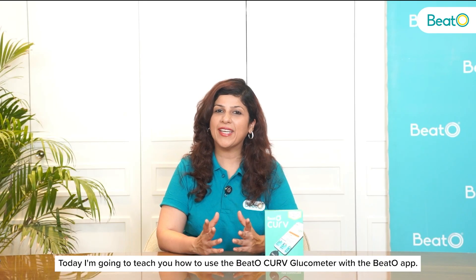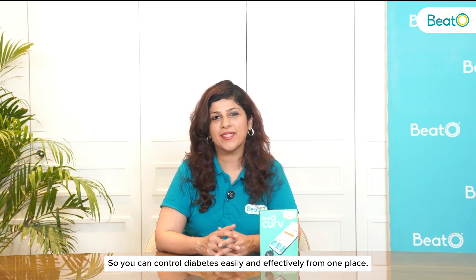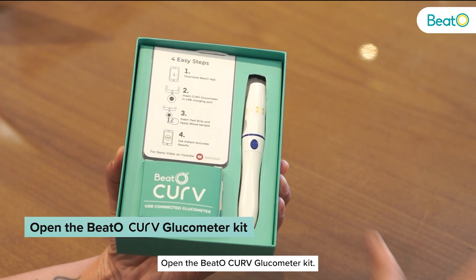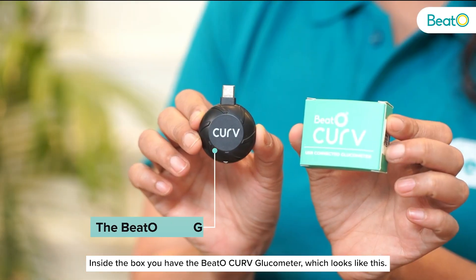Hi Beto family, today I'm going to teach you how to use the Beto Curve Glucometer with the Beto app so you can control diabetes easily and effectively from one place. Open the Beto Curve Glucometer kit. Inside the box you have the Beto Curve Glucometer which looks like this.